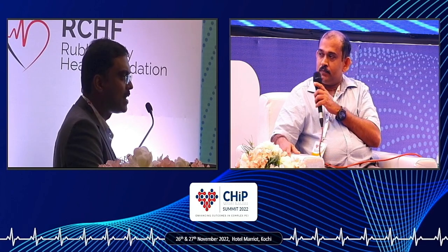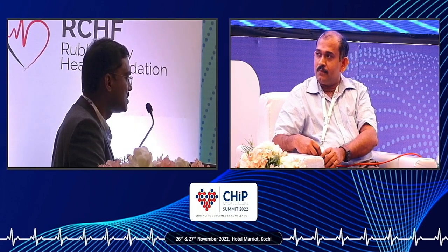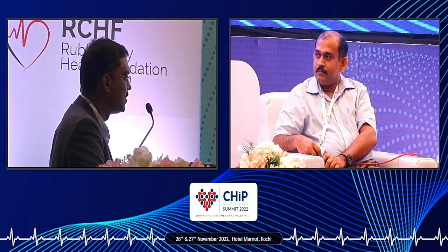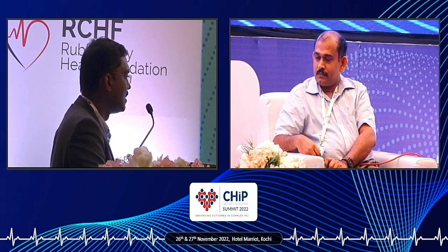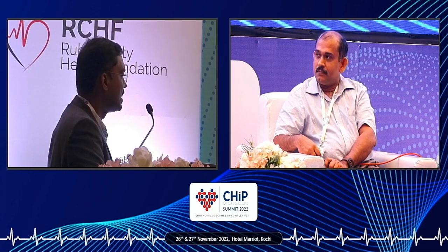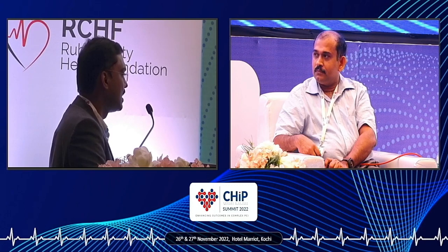Yes. For any restenosis, two things are very, very mandatory to me. One is stent boost, stent enhancer, which will give you the evidence for a stent gap or stent fracture, even though imaging can do. The second thing is to understand the mechanism. Though angiographically it may look properly expanded, if you go with imaging, it will be underexpanded. Without imaging, I will never do an ISR, because it's the second time we are doing a procedure on the patient. I am talking about the typical ISR. After doing imaging, we will understand what you need to do.